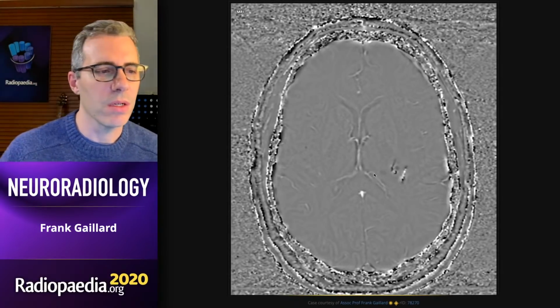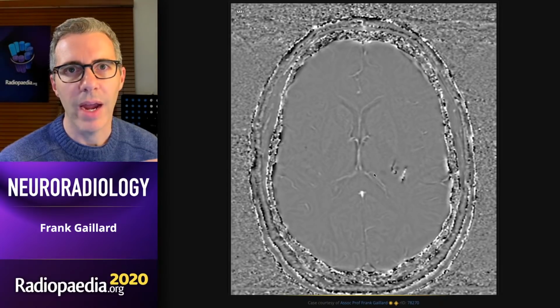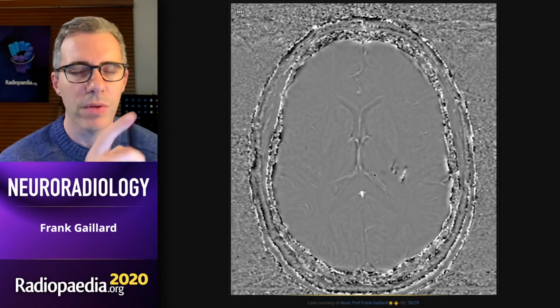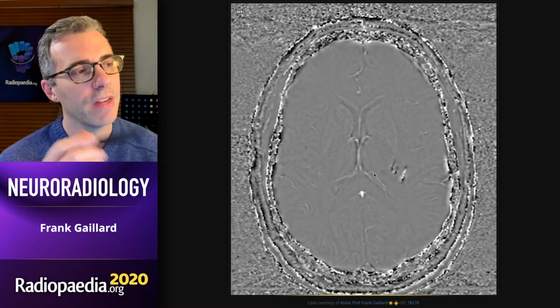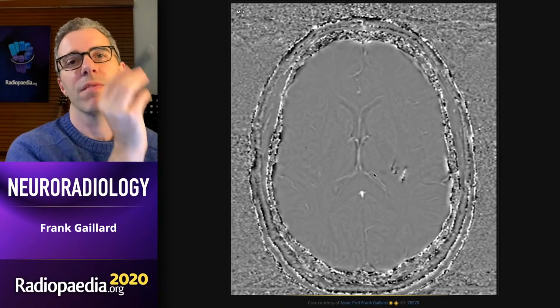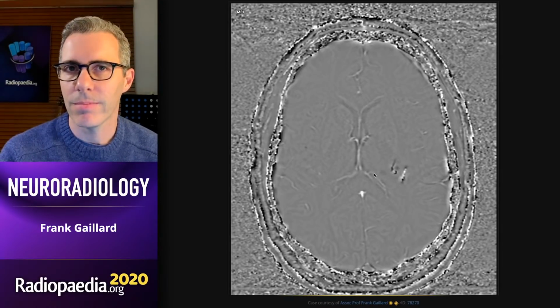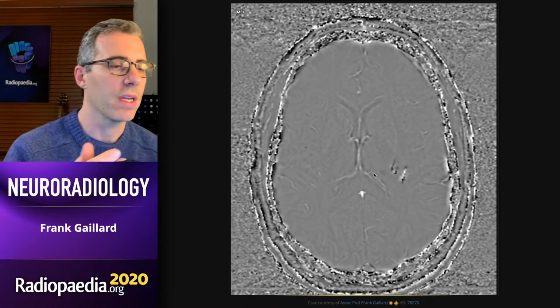Now, there's a little bit of a trick to this, because you'll notice that the bits that don't show phase shift, like normal brain, are your mid-value grey, so 128 out of 256 shades. Then how far you have shifted phase will be mapped either towards the black direction or the white direction. But the direction that occurs in will depend on the direction of your main magnetic field, and vendors have not agreed on a standard. Some vendors have the main magnetic field going from the head to the feet, and some have it the other way around. So there's no absolute way of just looking at it. What you need to do is look at some internal control to give you an idea of what paramagnetic, so deoxyhemoglobin and hemosiderin, does versus diamagnetic, calcium and dystrophic calcifications.